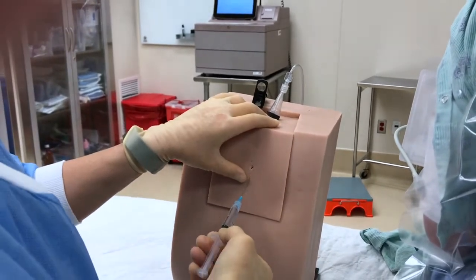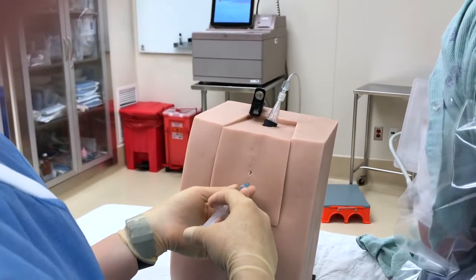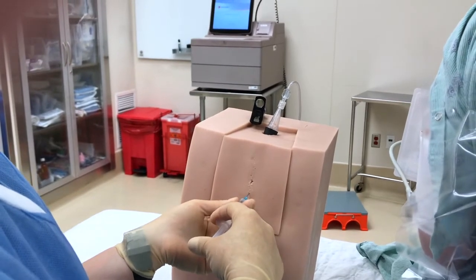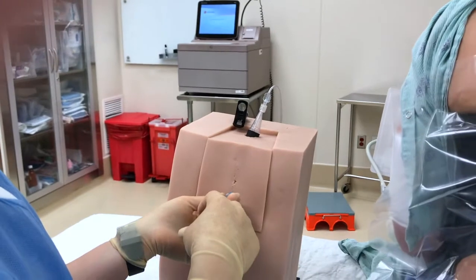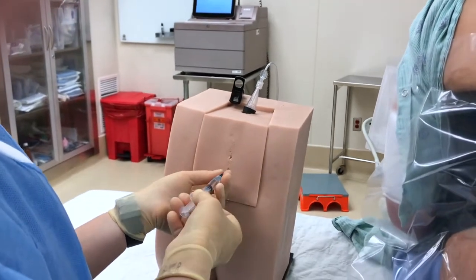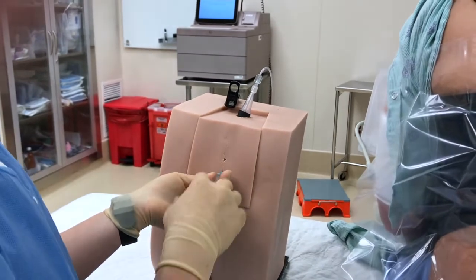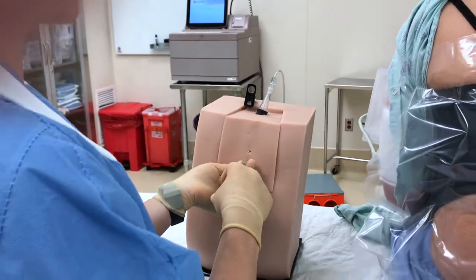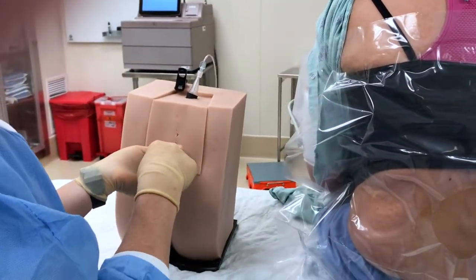So once you've created a really good superficial skin wheal, don't be afraid to give them a nice amount of lidocaine, inject all the way into the interspinous ligament, because anywhere that your needle path is going to travel, they're going to feel that. So go ahead and if you would like to, you can aspirate at the end if you're concerned, but usually this needle length is nowhere near the epidural space, and so you can feel free to kind of liberally give a good amount of lidocaine.